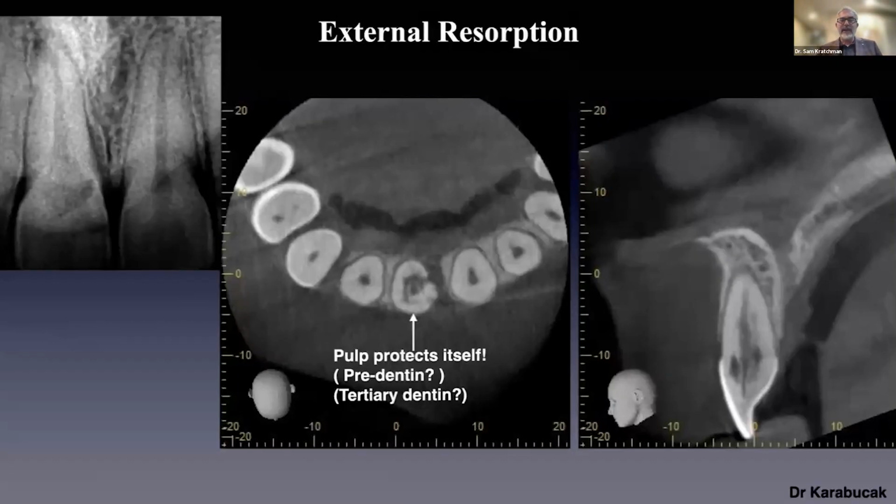Okay, this is great. The resorption starts coming in here. There's always going to be an entrance point, goes towards the pulp, stops, comes in this way, goes towards the pulp, stops, this way towards the pulp, stops, and it never invades the pulp. Look at how the tooth is practically destroyed here. In a lot of these cases, you just observe, and then you say to the patient, look, if it becomes symptomatic or any issues, then we can do the treatment.